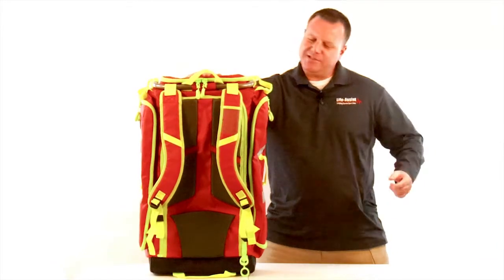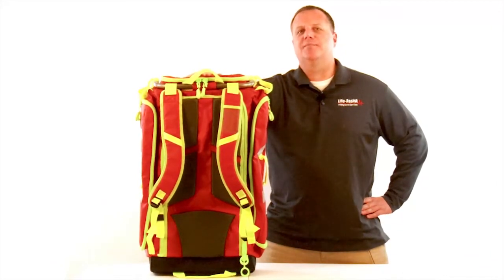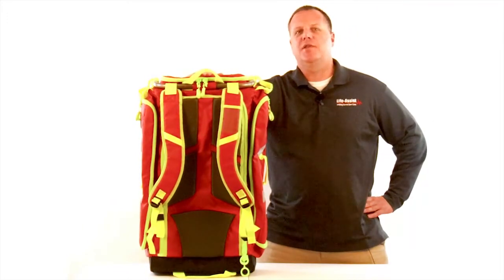Well, that's a look at the StatPax G3 Responder. This bag truly has something for every first responder agency's needs. Please make sure and join me next time when we take another deep look inside LifeAssist products. Thank you.